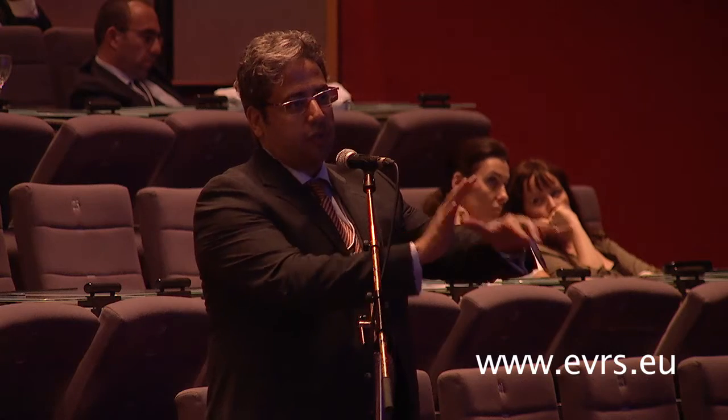I think this is the key. That's why I said this is the mistake that I made. Because it was the first case and I wanted to see the edge, to see where the retina and where the choroid is, and he was on Plavix. So in the future, like for the RPE choroid transplant, I would put PFC all over the eye, and I would cut both deep and move both of them as one layer under PFC. So you tuck them underneath, or you just put them on top?